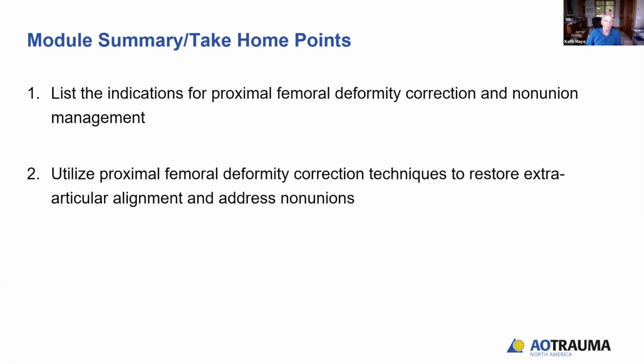Well, if you have a stable osteotomy bed and you have good bone, the screws are adequate. But the insurance policy is a tension band wire, which usually goes underneath the shoulder of the plate. And that is a soft tissue tension band, typically, unless you have a very large trochanteric fragment, you don't try to go through bone, and the trochanter basically is going through the medius tendon. It's a tension band. Anybody have any other thoughts?